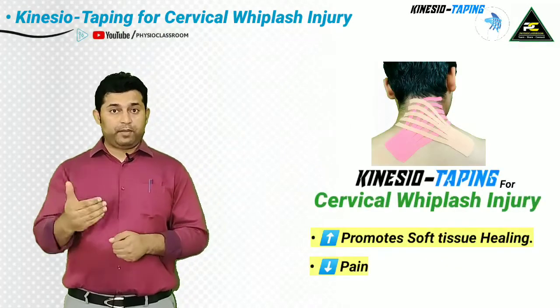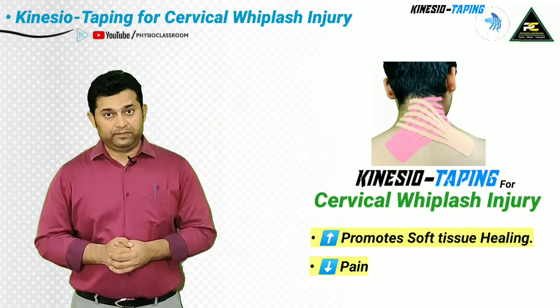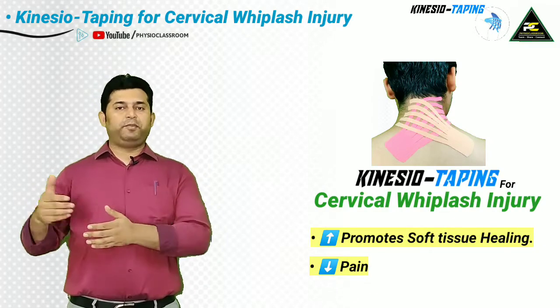Also, kinesio-taping can promote soft tissue healing, thereby facilitating the normal recovery. So let's get started with the practical demonstration of the kinesio-taping technique for cervical whiplash injuries.